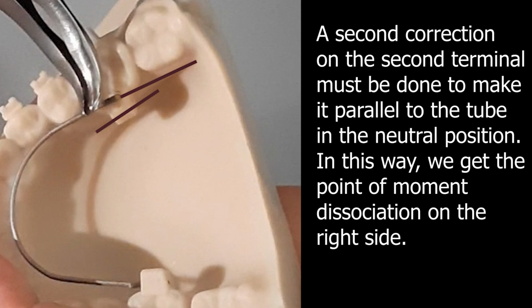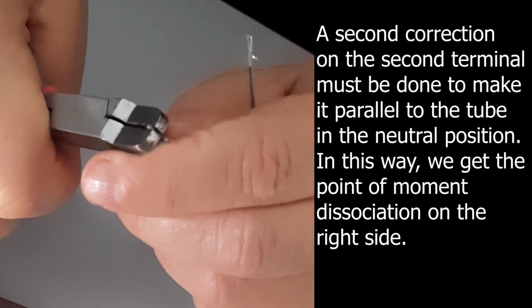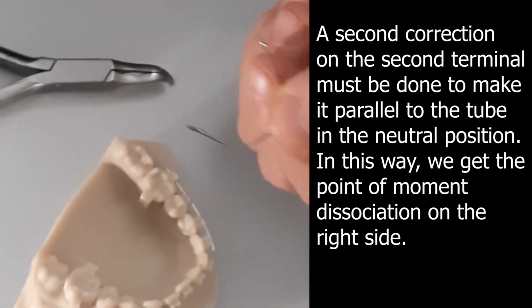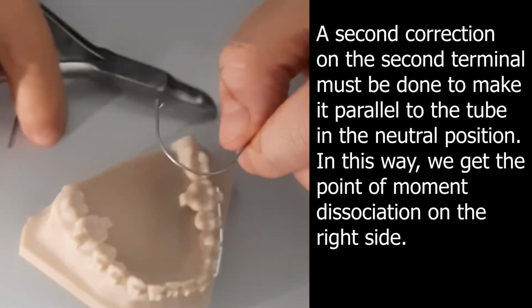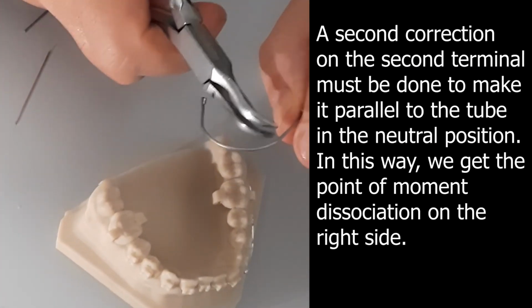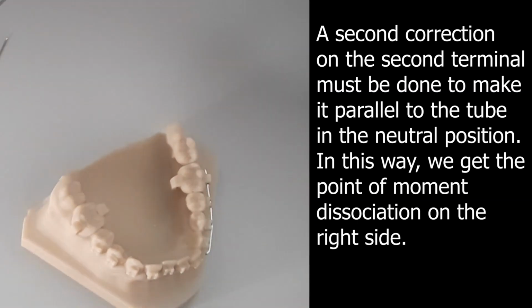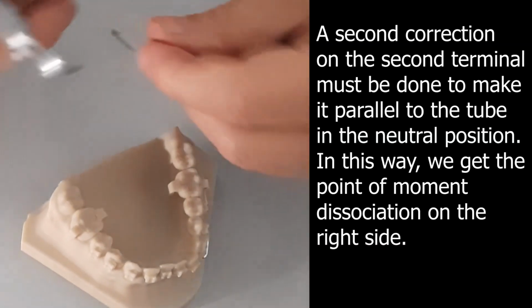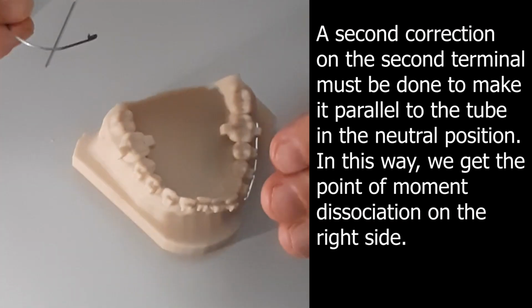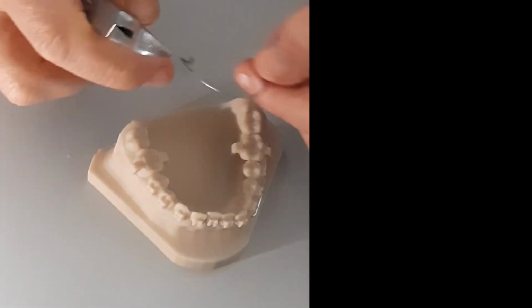So if there was a bit, I think there was a little bit. I have to give a bit of this correction. Yeah, transversal. So now the transversal was corrected before. Now I corrected the rotation. Okay? Because there is a problem: if this is active for rotation, it is again influencing the transversal. So if you want to understand something, you have to have the neutral position corrected, both for the transversal and for the angulation, that is the rotation. Okay?